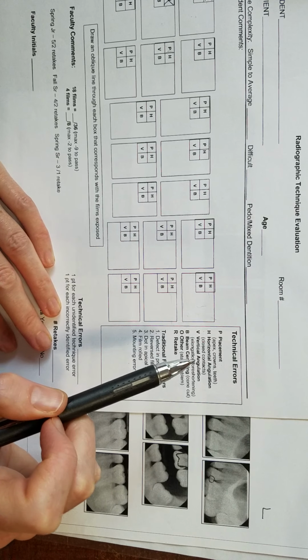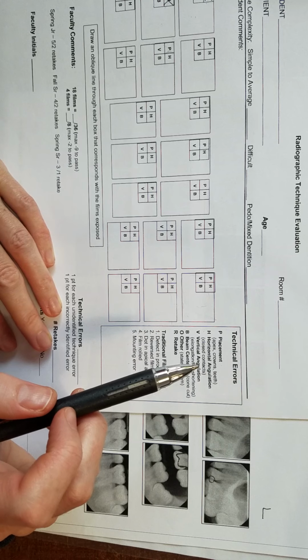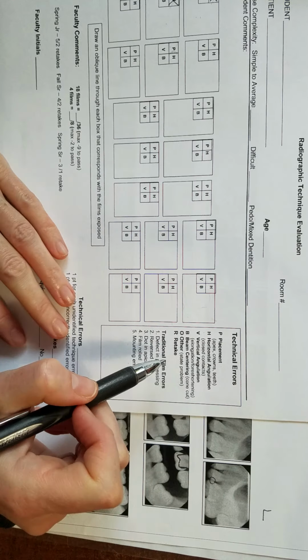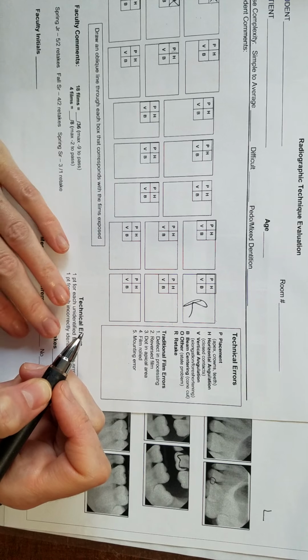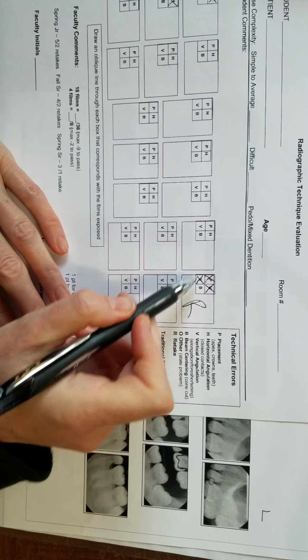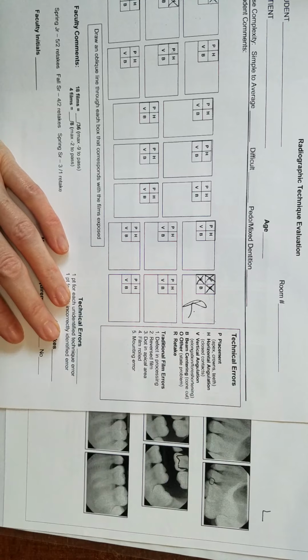Other could be like if you had the sensor turned around backwards and it didn't expose it, or say you had the XCP set up wrong and it didn't end up taking a picture, or something like that. And then if you do need to take a retake, you'll put an R in the box. So if you had a bunch of errors and then you didn't get what you needed to see anywhere else, then you'd put an R there.